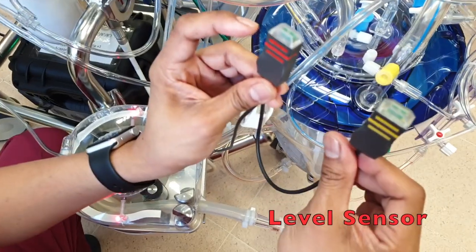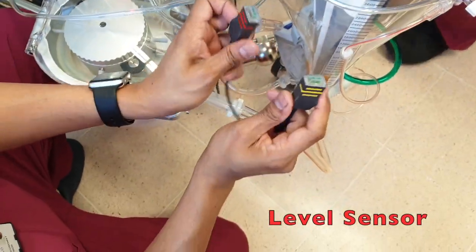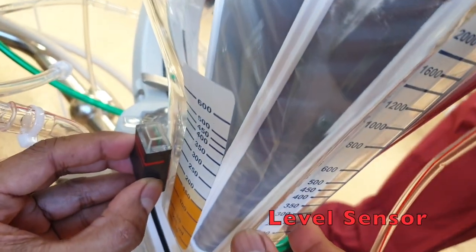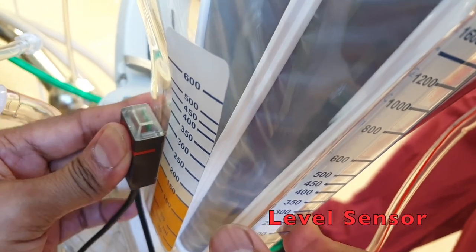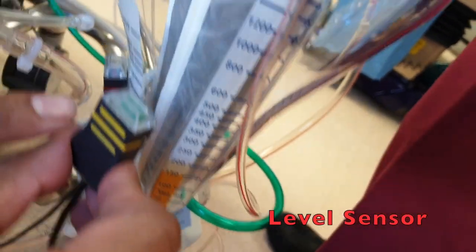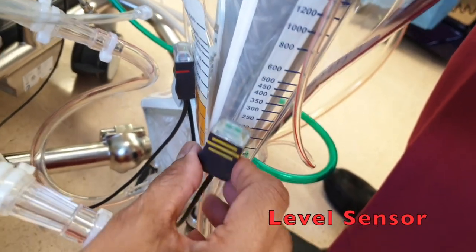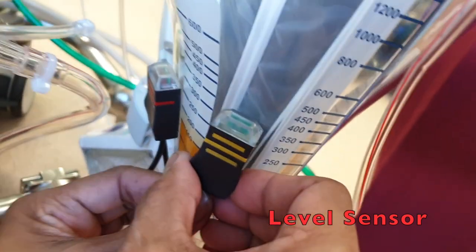Level sensor. What is red, what is yellow? Both are level sensor. Red is for the protected flow. We call it protected flow. So it will stop the pump when it hits the level. And then the yellow is the safe flow. So when it reaches the level, the flow will adjust. So that's how it is.